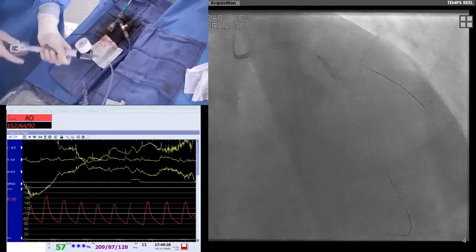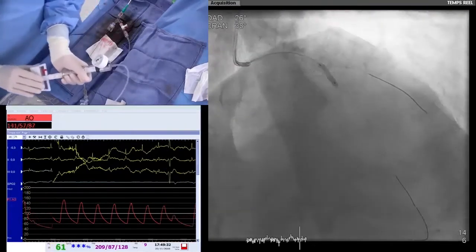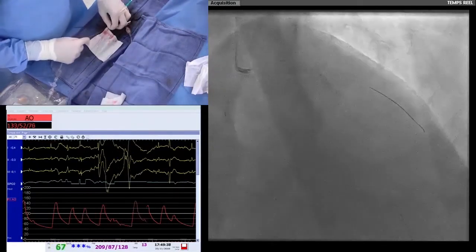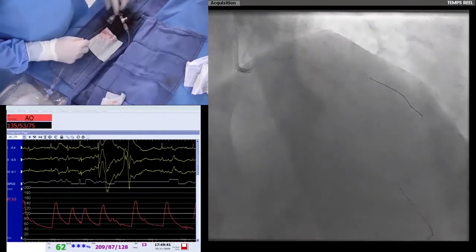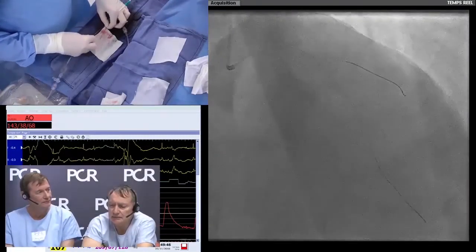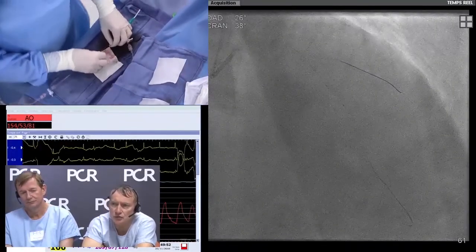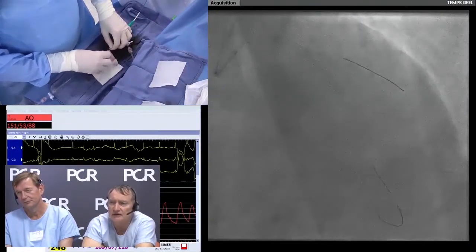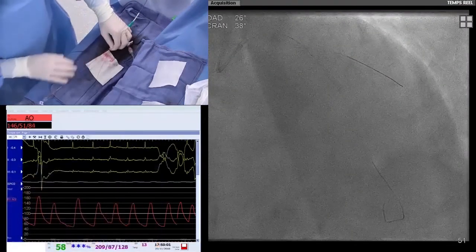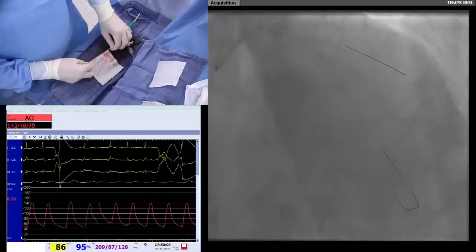Yeah, I agree. It gives you a false reassurance that you are protecting the left main, but actually not. It doesn't tell you exactly how the situation is, let alone the amount of contrast that you inject, which is always higher than with this kind of guiding catheter we are using now. And a general question, do you place a balloon over a normal wire or over the rota wire when you use a ROTAPRO, for example? Over the regular workhorse wire. Yes, to have better support, I use the workhorse guide wire. In this case, not an extra support guide wire. Okay, you delete the rota wire. Yes.